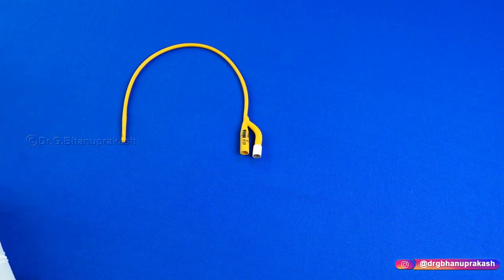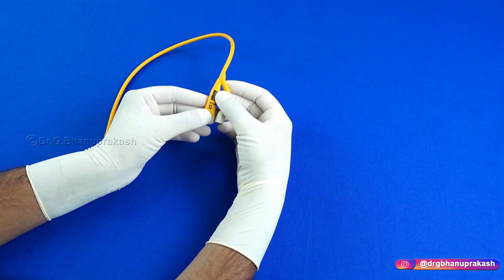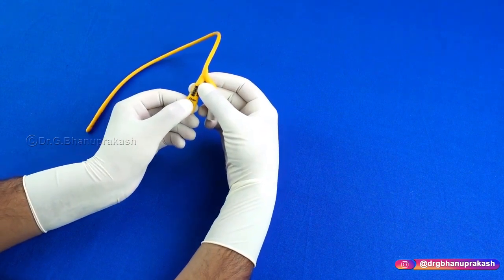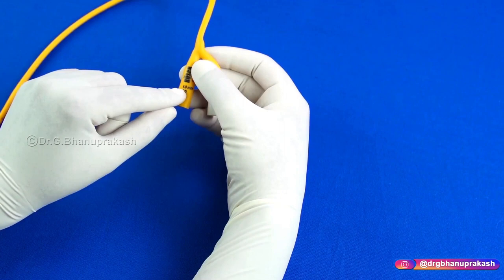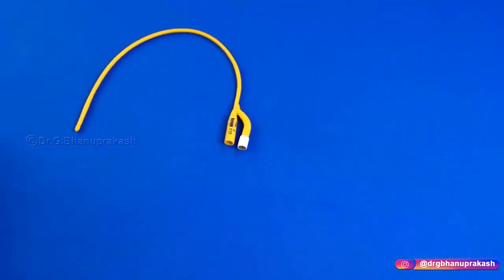As the size increases, the diameter also increases. For example, this is size 12, which has a diameter of 4 mm. In the same way, size 22 will have a diameter of more than 4 mm. Now let us see how to insert a Foley's catheter.